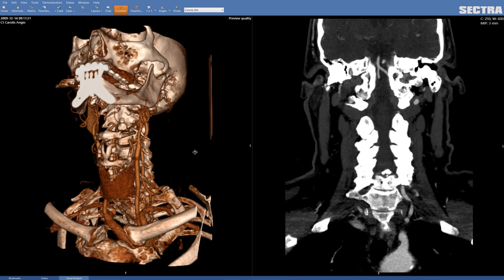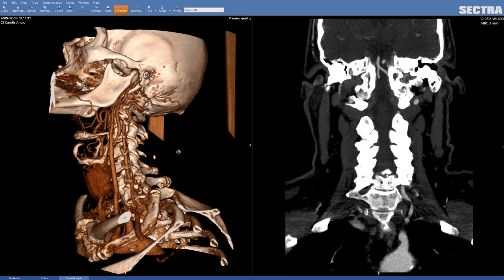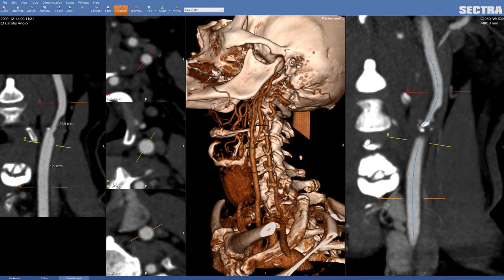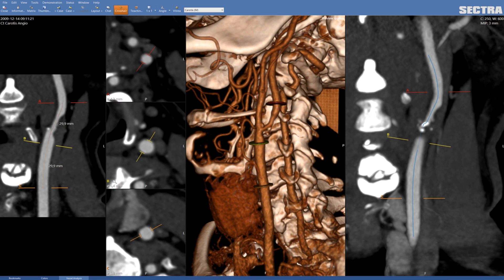To create the center line through the vessel, you just press on the interested vessel one time and then press double click. The computer then calculates a center line through the vessel and also computes the cross-section view along the center line.